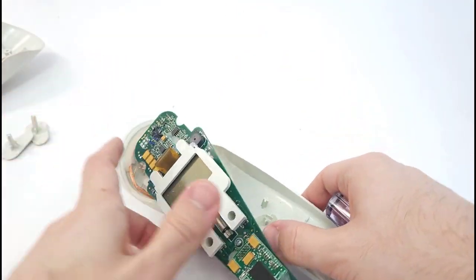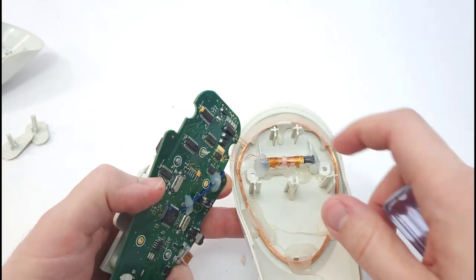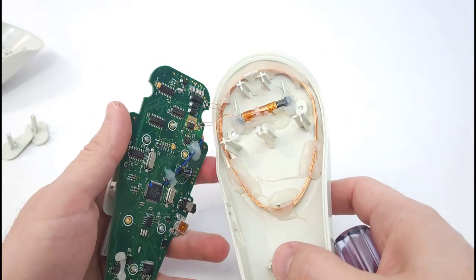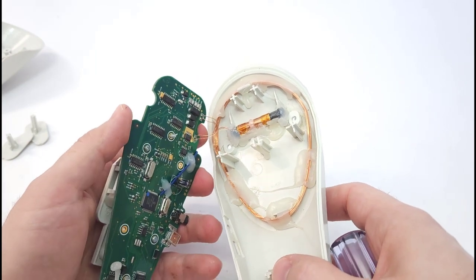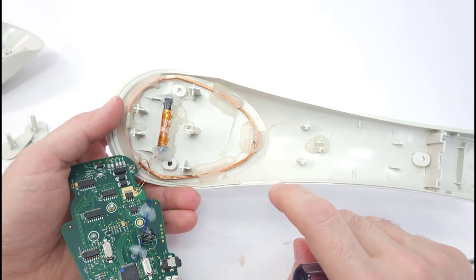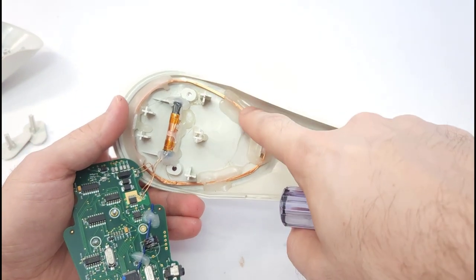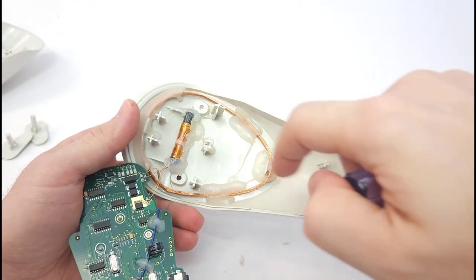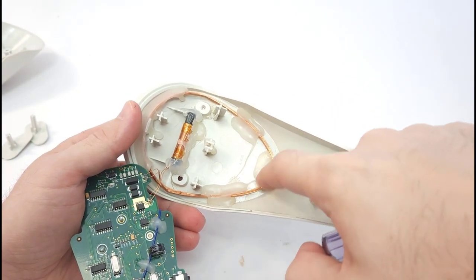Okay, be careful pulling this off because it is connected by some very thin wires to these coils here, so you want to keep this connected and just bend it off gently. You don't want to yank it or you might break those wires. And again, now you have access to the bottom of the case where there's two things. There's the big coil here and then there's the tighter coil with the metal core. In my experience, the big one is not the one that comes loose.